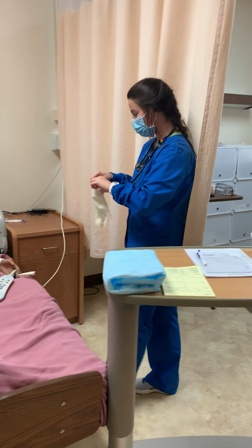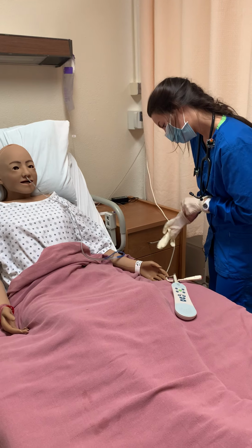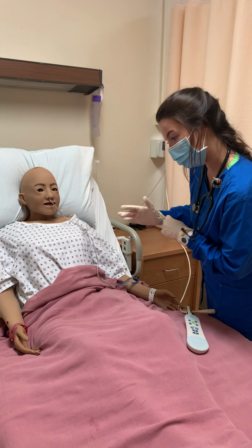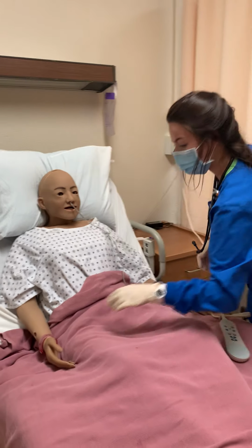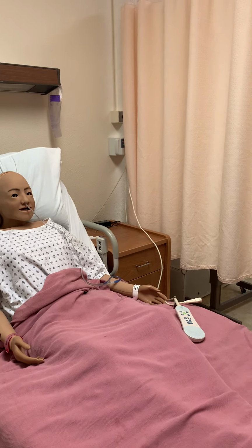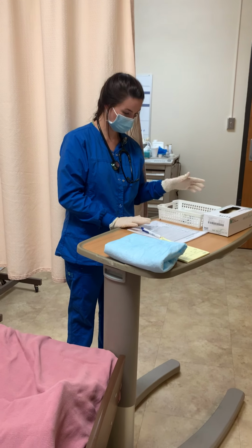Okay, Joanne, could you confirm your name and date of birth for me? Joanne Jones, 12/3/1967. Perfect. And what are you allergic to, Joanne? Penicillin. Okay. And then I would have done my second check with my Lovenox injection too, right outside the door, just making sure once again that I have the right medication.